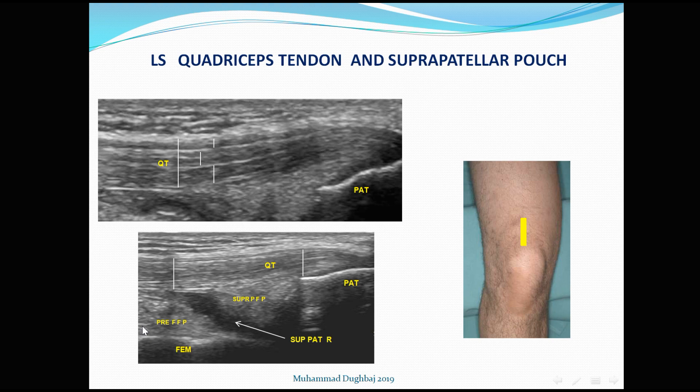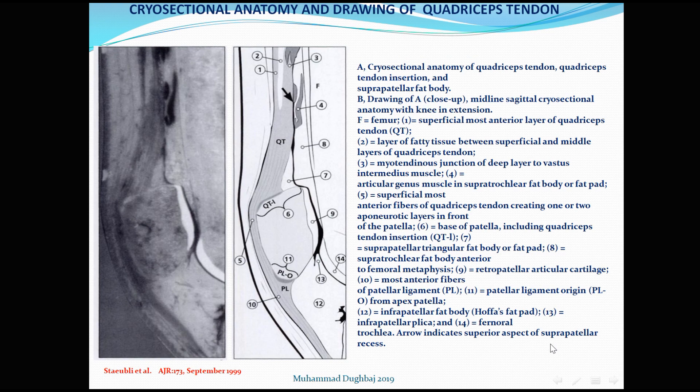We can see here that the suprapatellar fat pad shows no encroachment during extension over the patella or the bony cortex of the femur. This is the anatomical cross-sectional anatomy showing the quadriceps tendon, pre-femoral fat pad, suprapatellar fat pad, suprapatellar bursa, articularis genus muscle, and the extensor mechanism including the quadriceps tendon and patellar tendon.